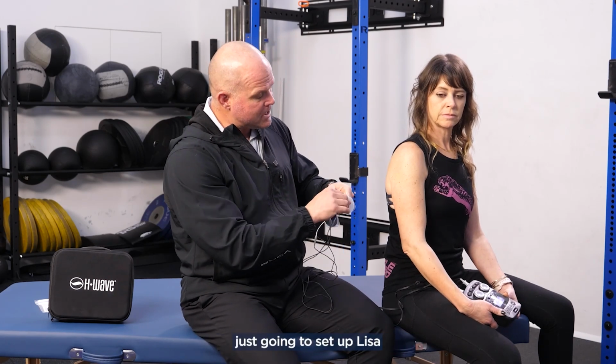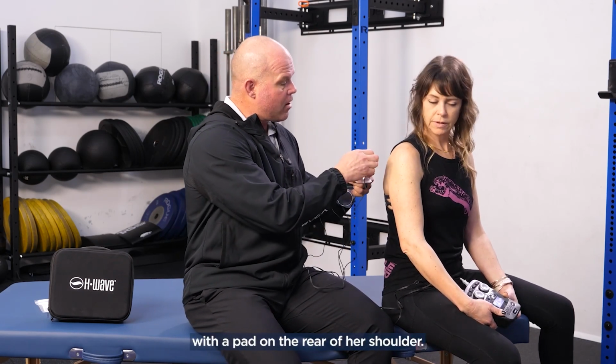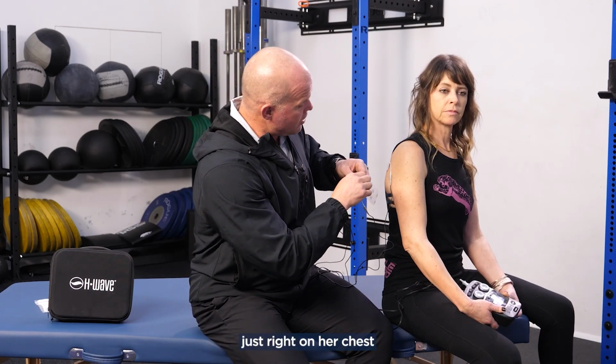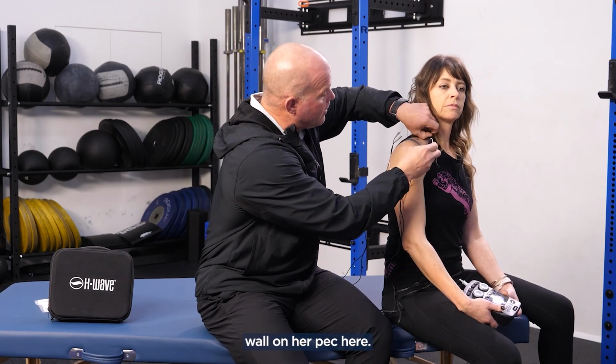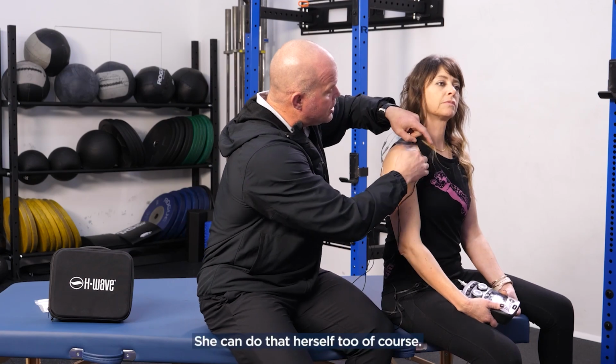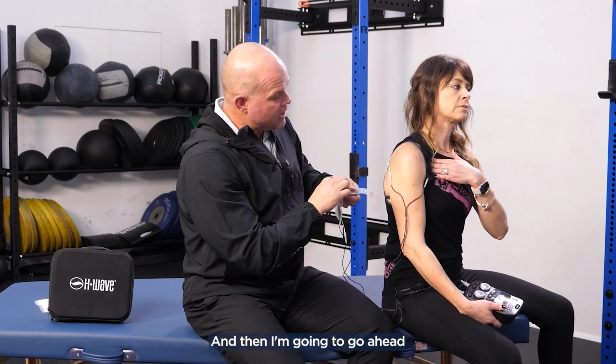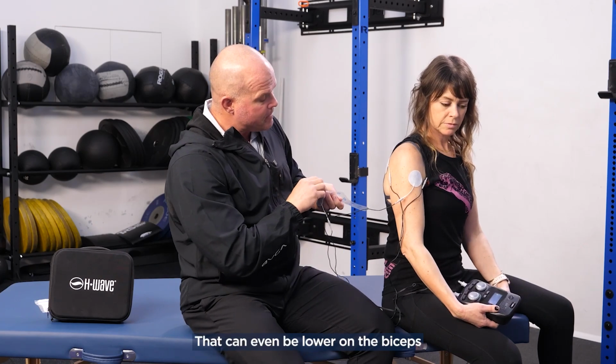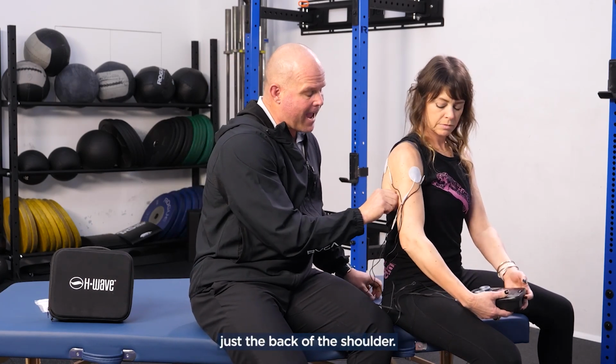So in this situation, I'm just going to set up Lisa with a pad on the rear of her shoulder. I'm also going to set one up right on her chest wall, right on her pec here. So I'm just going to put that right on her pec. She can do that herself too, of course. And then I'm going to put one on the front of the shoulder. That could even be lower on the biceps, and on the triceps, just the back of the shoulder.